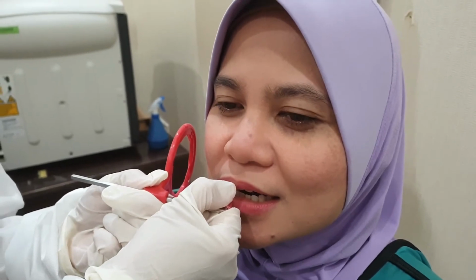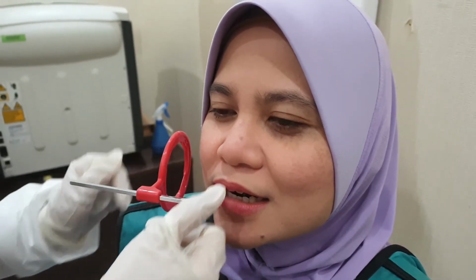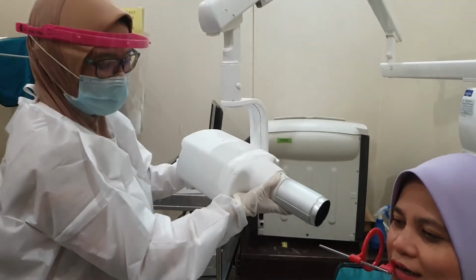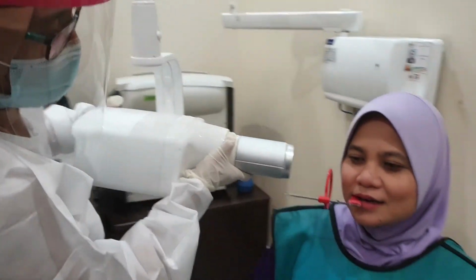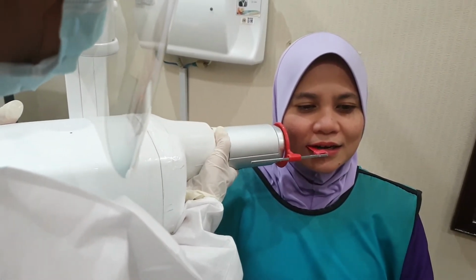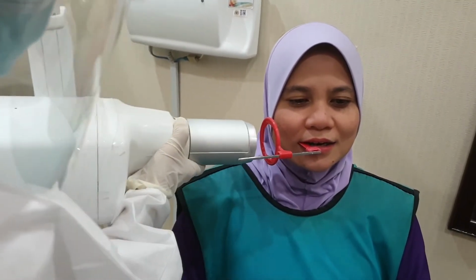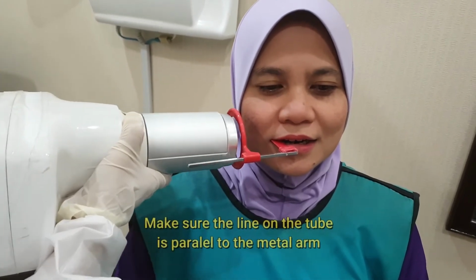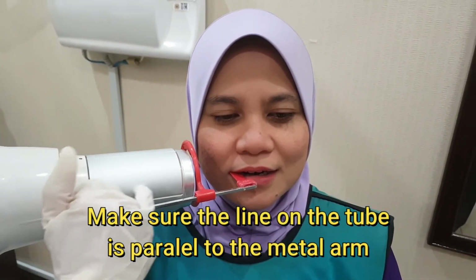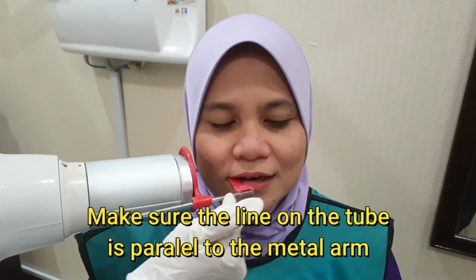Adjust your locator ring and then get your x-ray tube. Okay. Place your x-ray tube as close as possible to the locator ring. Right. It is important for you to make sure that the line on the tube is parallel with your metal arm.